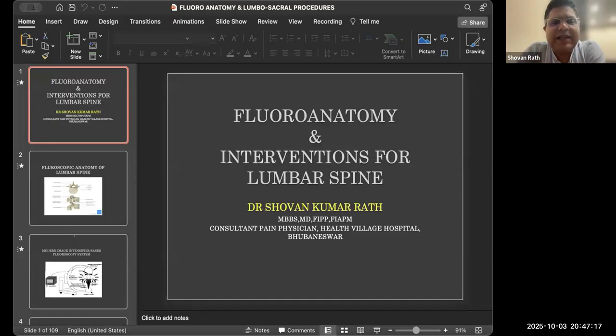Then you take the patient inside the OT. Suppose somebody is diabetic, somebody is hypertensive, they should not stop their medicines. The medicine should be on. And next thing is, there is no specific contraindication unless there is some bleeding disorder. If the patient is taking some drugs, as I said, anticoagulant, that must be stopped. Otherwise, there is no specific contraindication. And after doing a local anesthesia test, you can take the patient inside the OT.